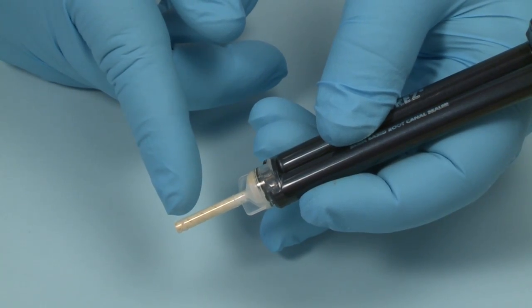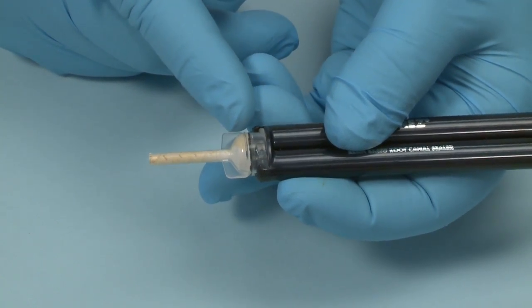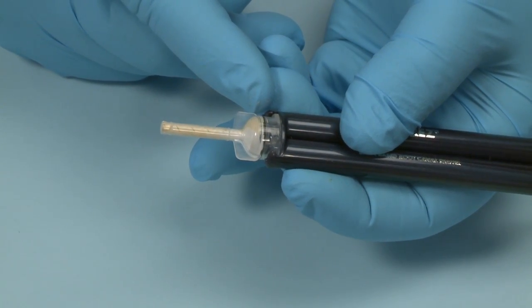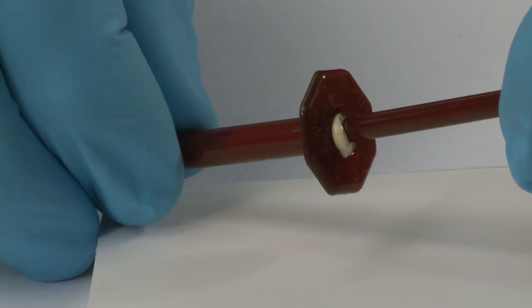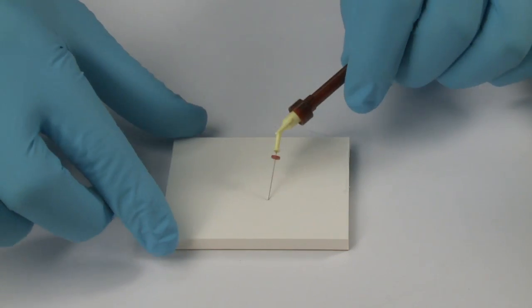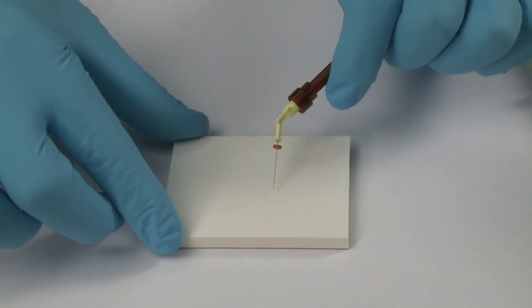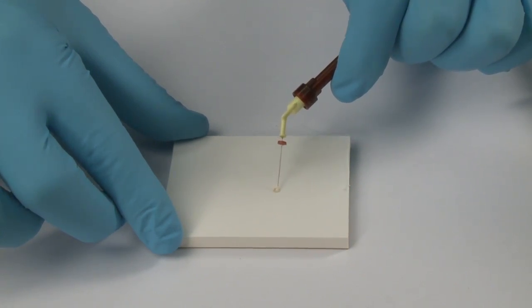Leave the mixing tip on the dual barrel syringe of EndoRes as a storage cap. The chemical will set in it, but the tip will be replaced during the next procedure. After making sure the Navi tip is securely placed, put the plunger back into the skinny syringe and express the air from the syringe. You may wish to express a small amount of EndoRes through the Navi tip to confirm that it is flowing properly.